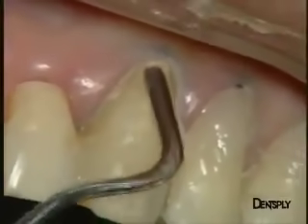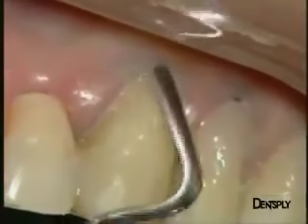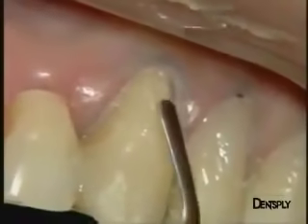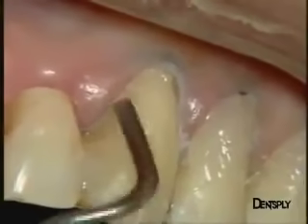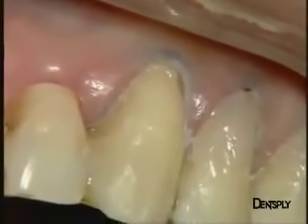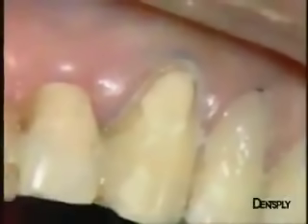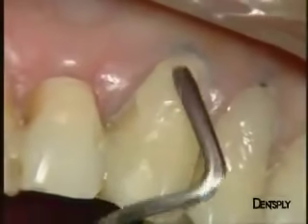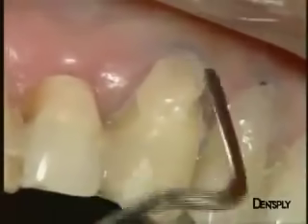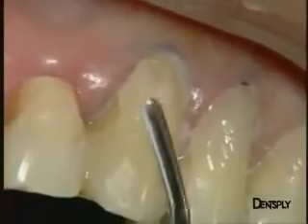By the first increment, you already notice the shade difference between the A3 on the premolar and the A3.5 on the canine that matches well with the residual dental structure. Again, the absence of voids is due to the fact that we place the material, whether composite resins or compomers, with a steady pressure. It is vital to avoid spreading these resin materials, since this would inevitably cause air inclusion within the structure of the filling materials that could then appear during the polishing stage.